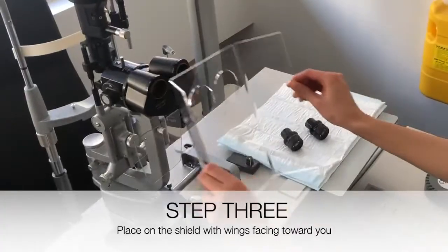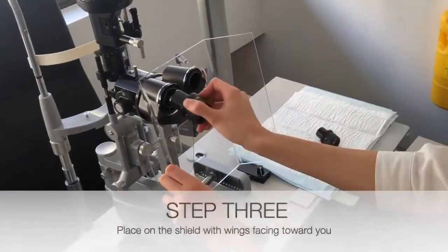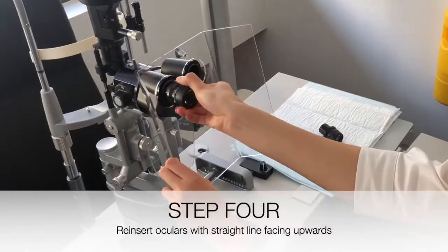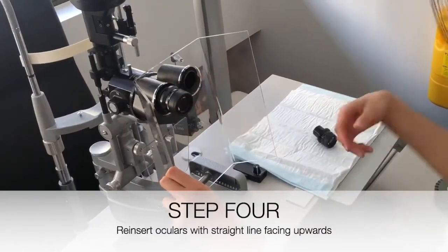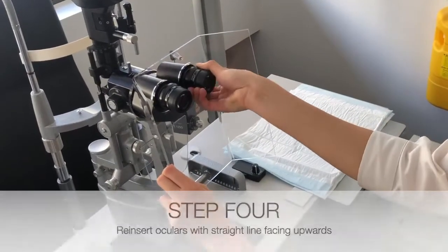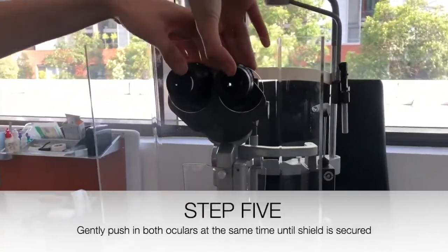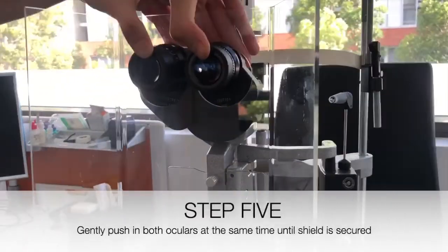Step 3: Place on the slit lamp shield with wings facing towards you. Step 4: Reinsert the oculars with the straight line facing upwards. Step 5: Gently push in both oculars at the same time until the slit lamp shield is secured.